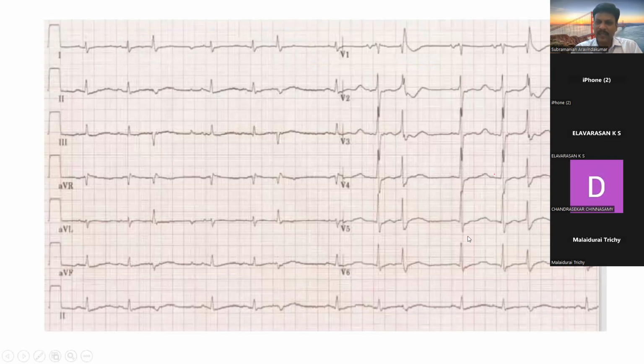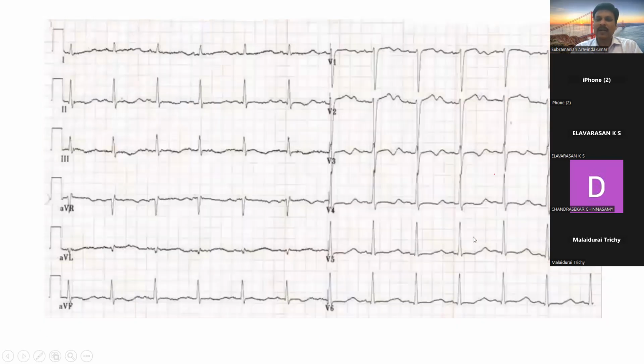See the basic ECG, it is completely prolonged, and you have a U wave which is upright and prominent. You can see this here. It is a QT prolongation, QU prolongation rather, and you can have a prominent U wave, ST depression with a tall upright U wave, which becomes prominent because of the ST depression. Typical of hypokalemia, see here ST depression, upright U wave, QT prolongation. The other waves are near normal. You can see the P wave, QRS complex is normal.